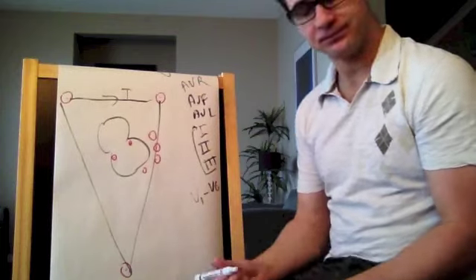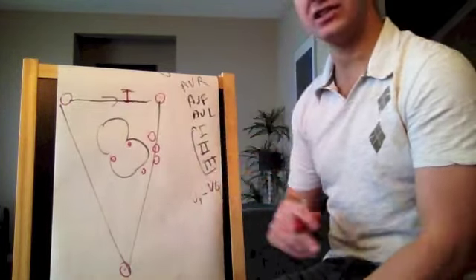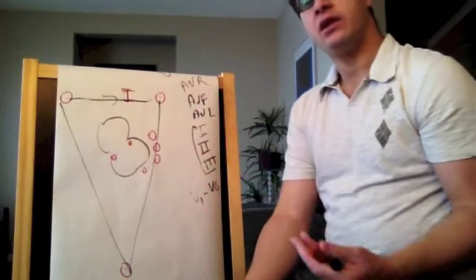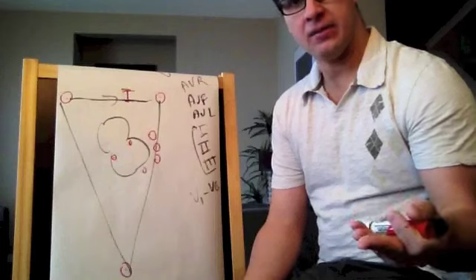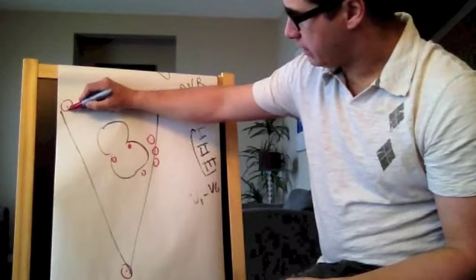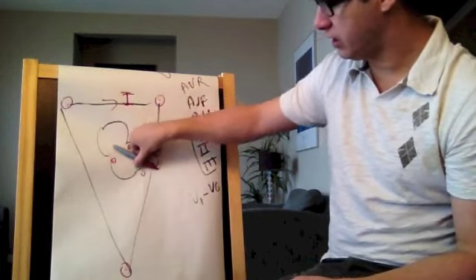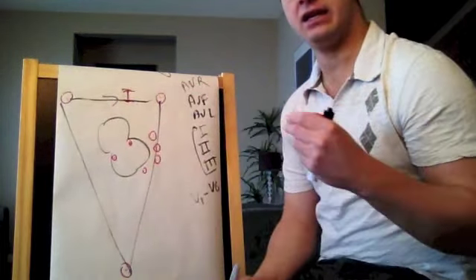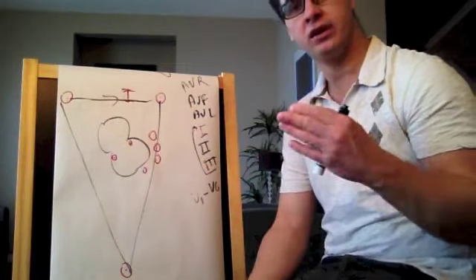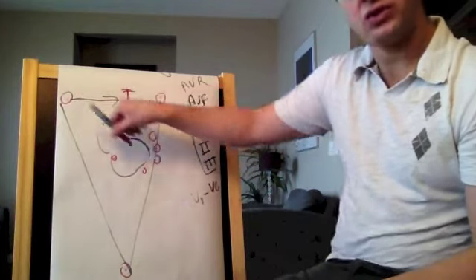That's lead 1. Actually, yeah, that's right in there. That's lead 1. Lead 2, and this is why most of the time when we monitor someone, we will read lead 2, because it is in the axis that the electricity mostly travels. So that's why we put our monitor mostly in lead 2, because the electricity is going like this.